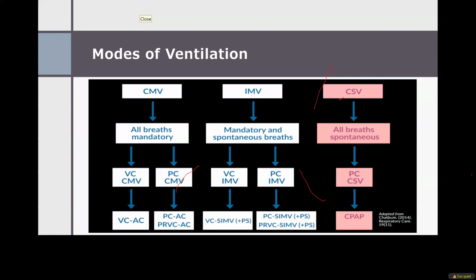How long would you advise suctioning before a blood gas is done? Suctioning is PRN, as needed, and not routinely before every blood gas. If we do suction, then we wait at least an hour before getting a blood gas. Because suctioning is on an as-needed basis. So if there's a problem and there are secretions you have suctioned, then you want to wait a little bit until the baby re-equilibrates to the normal situation.